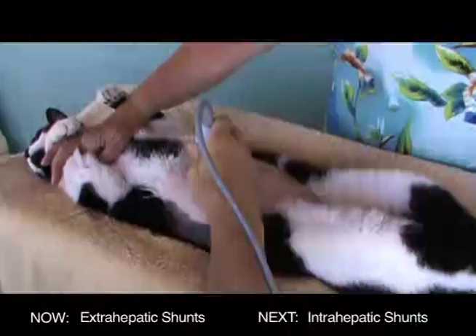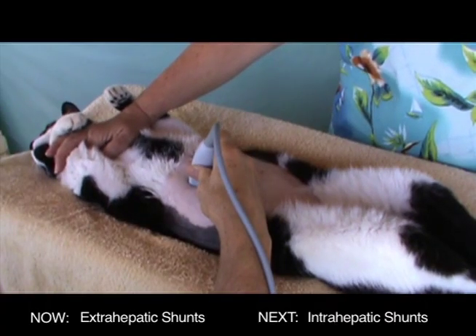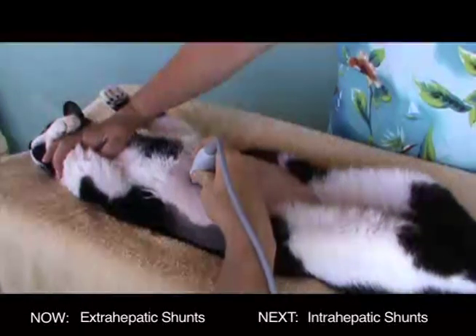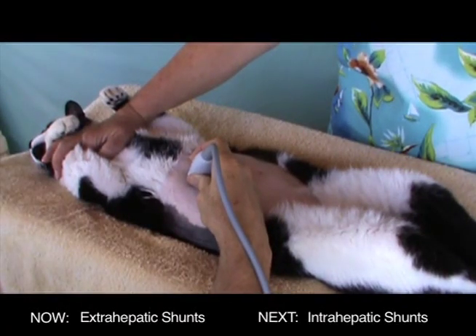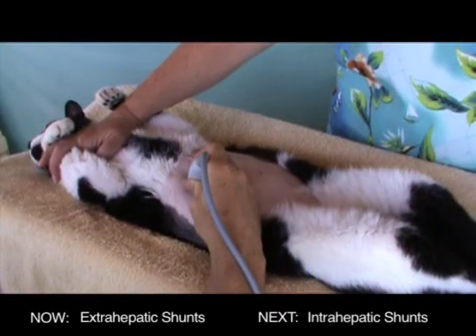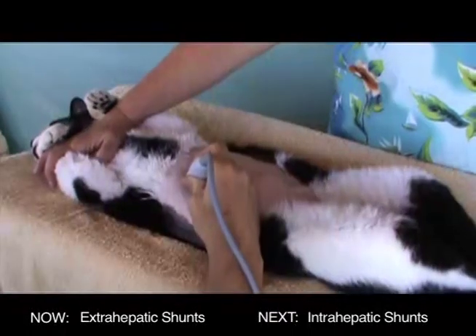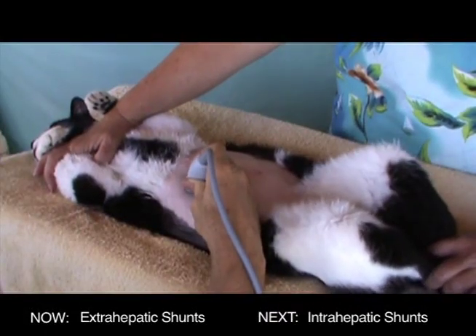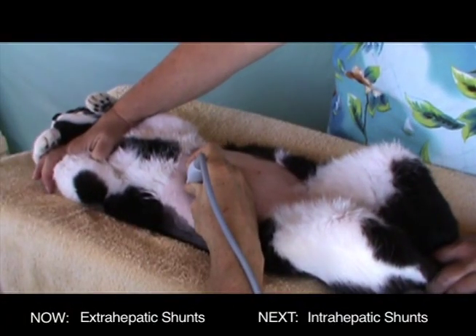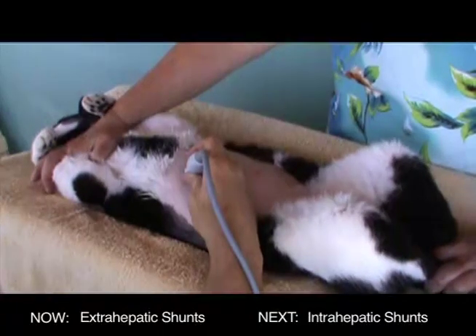One method of finding an extrahepatic shunt is to compare the diameter of the portal vein, caudal vena cava, and aorta in a long-axis view. To find these structures, begin with the transducer in a ventral midline sagittal view of the liver at the xiphoid. Slide the transducer to the patient's right side and then fan back to the patient's left to find the portal vein at the porta hepatis.